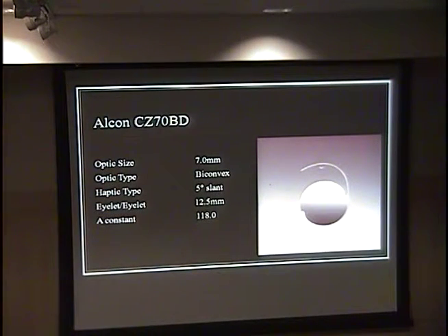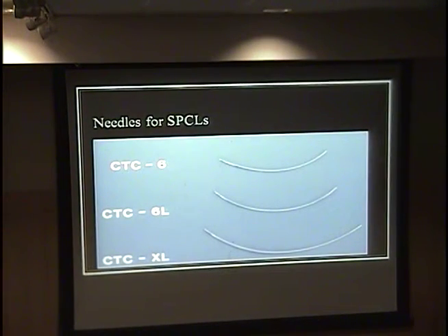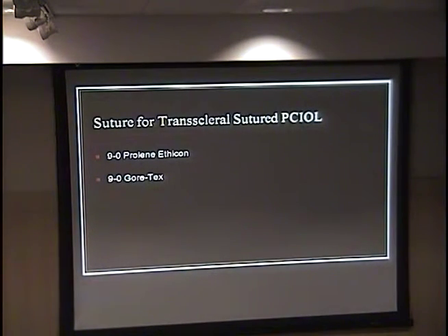So this is the lens that they use, a CZ lens. It has these eyelets, so you can pass your sutures through there to secure it. These are the needles, the CTC needle. You should use either Prolene or Gore-Tex. Dr. Crandall seems to use the Gore-Tex in children.